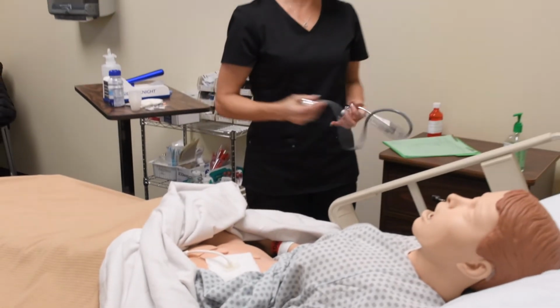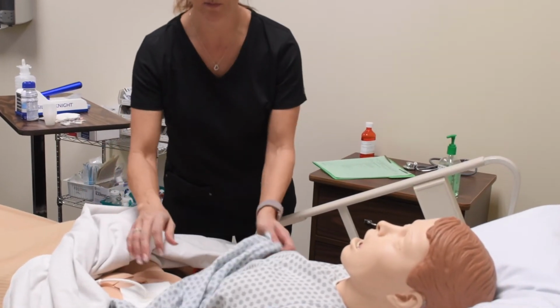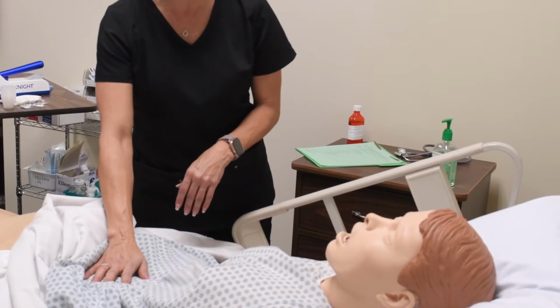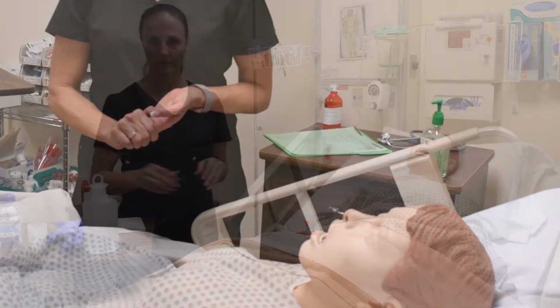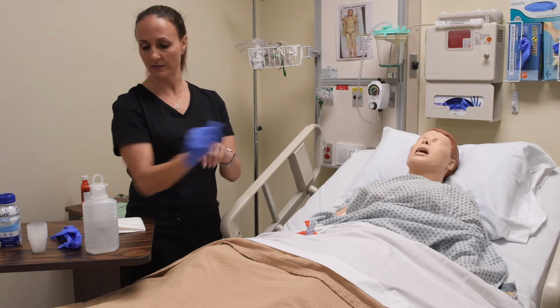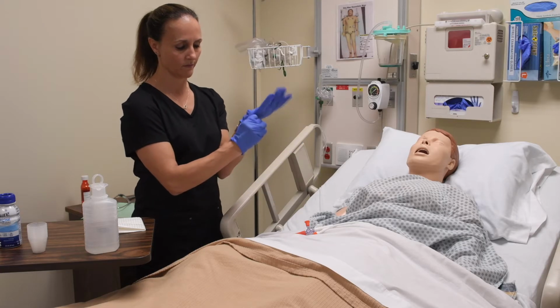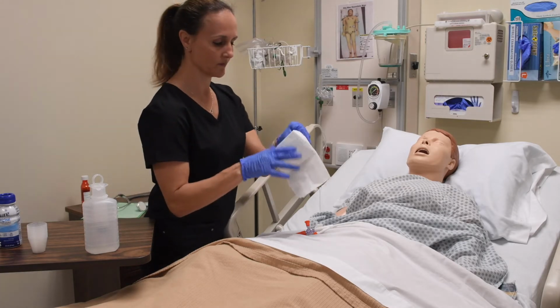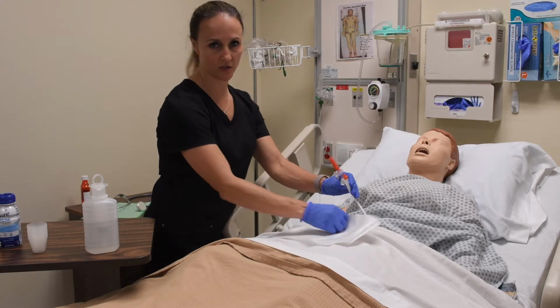Ms. Jones, do you know the last time that you had a bowel movement? She may or may not have had one recently, but you want to make sure that your patient has bowel sounds before you ever give any kind of medications or any kind of feedings. First thing I'm going to do is apply my gloves, which are just clean gloves. I'm going to get my towel, and this is just in case I have any leakage, I have my towel just to protect the patient.